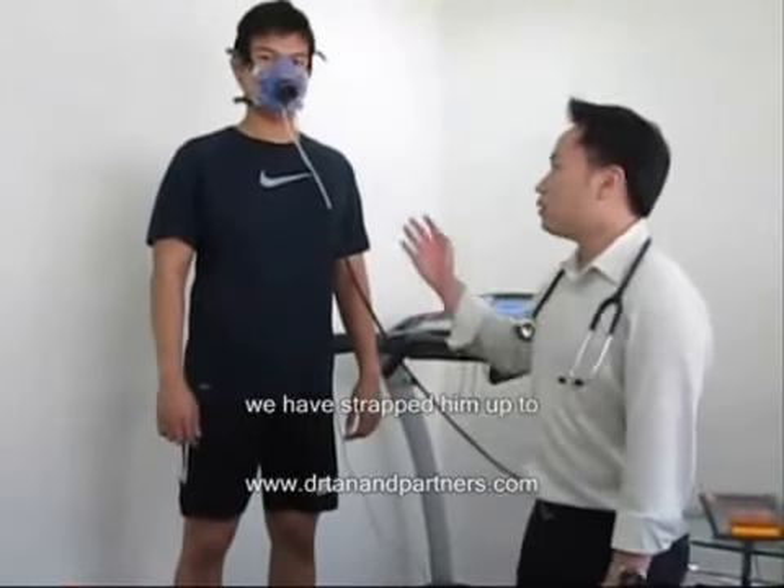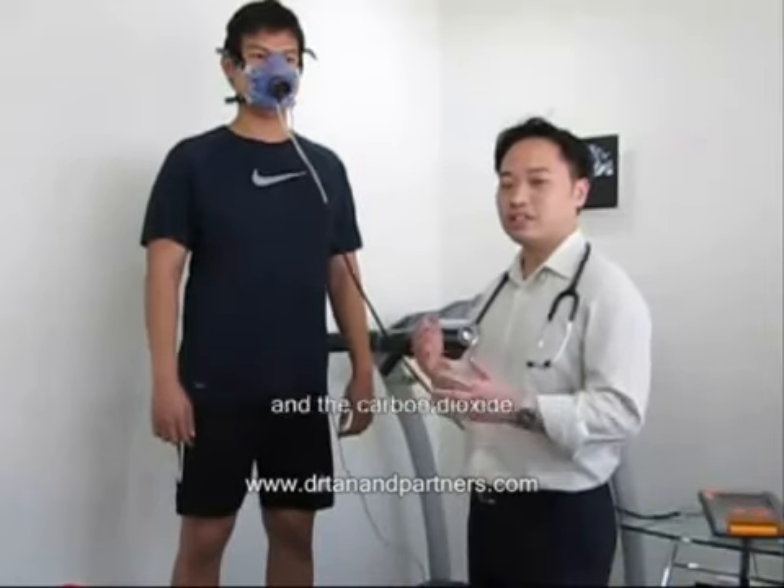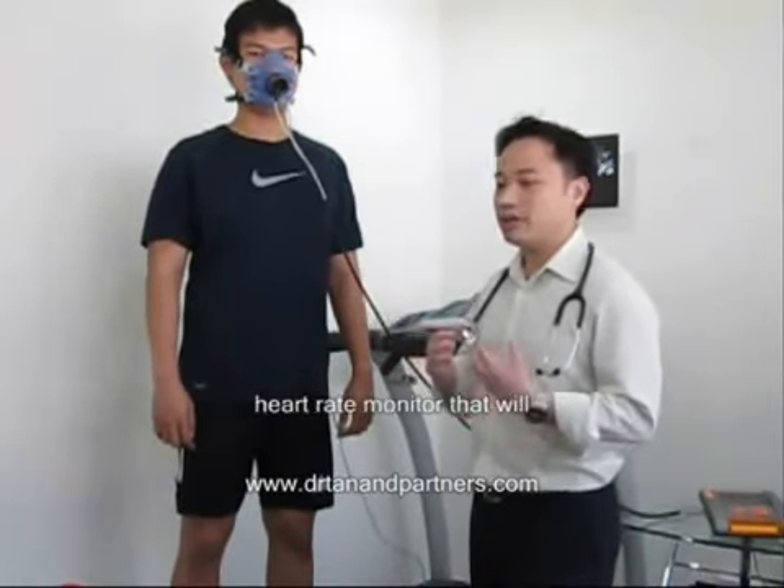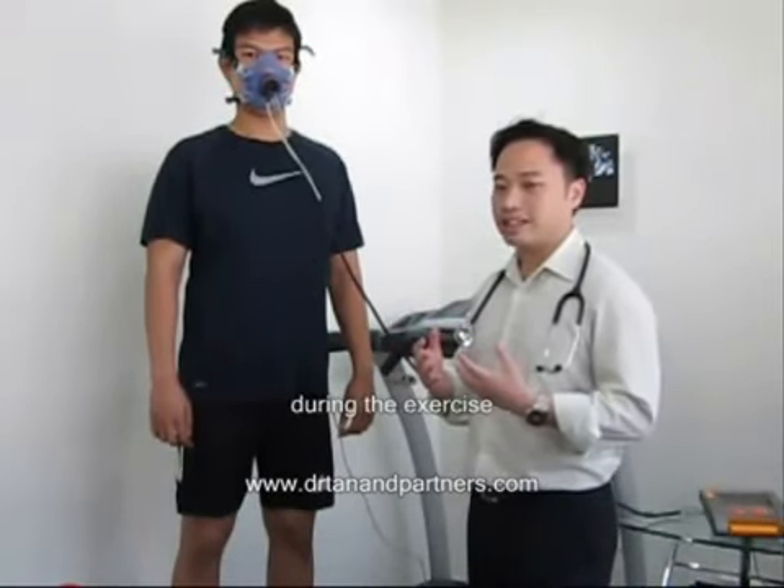You can see that we have strapped him up to a face mask that will measure the air exchange as he exercises, and underneath his t-shirt is a heart rate monitor that will measure his heart rate during the exercise.